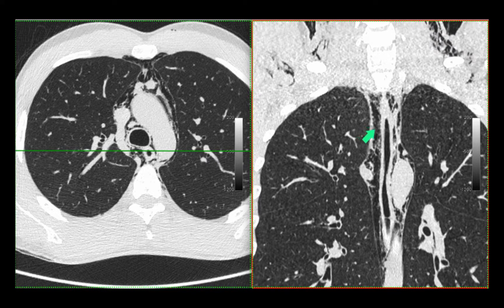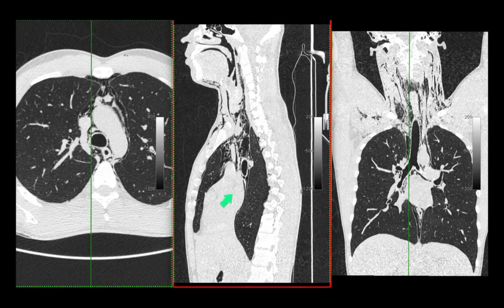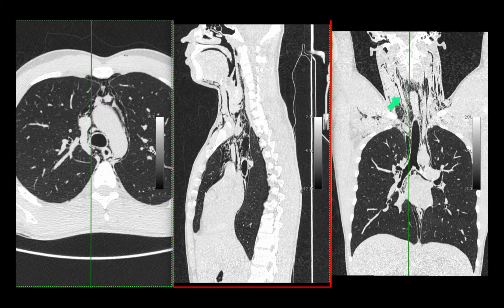This is a coronal reconstruction showing the oesophagus, which is nicely demonstrated. There is the wall of the oesophagus, and here is gas in the mediastinal compartment. Here is the aorta, and there is the azygous vein. Here is a sagittal and coronal section which shows very nicely the mediastinal gas tracking up into the pre-cervical soft tissue, the sublingual subcutaneous fat, and into the subcutaneous fat of the anterior chest wall. This is the coronal reconstruction showing the gas tracking right up into the neck.